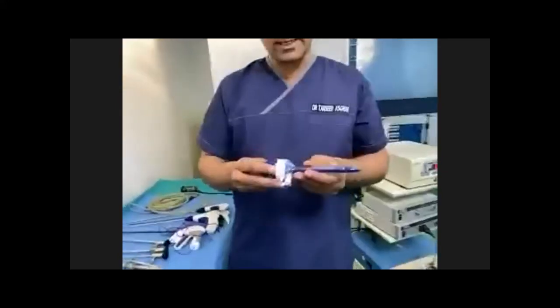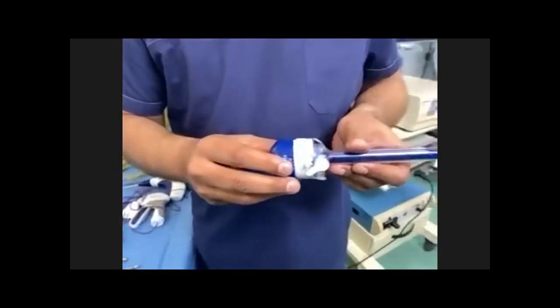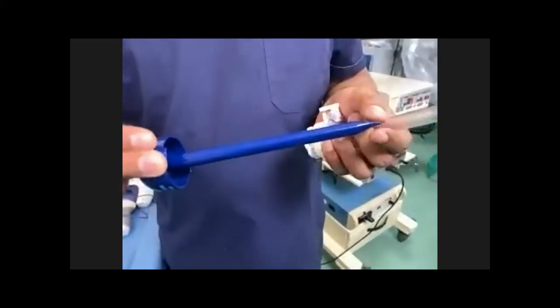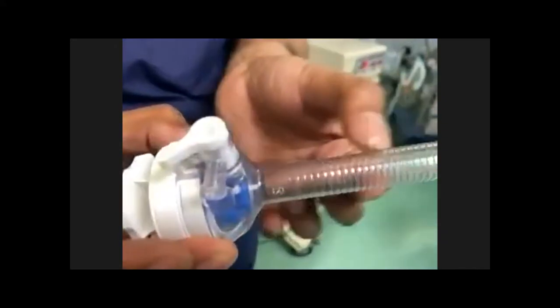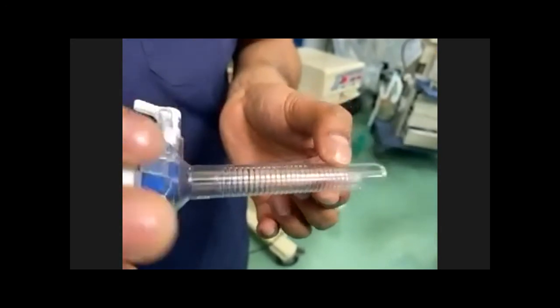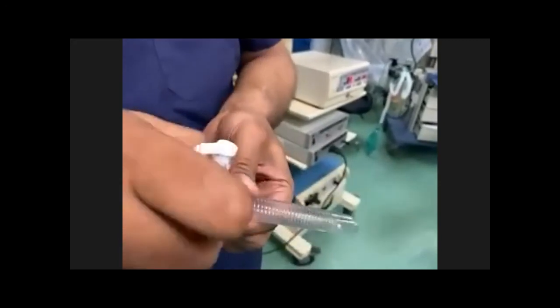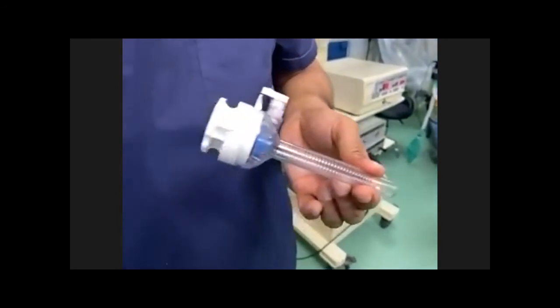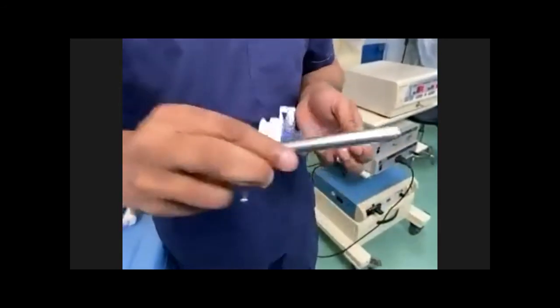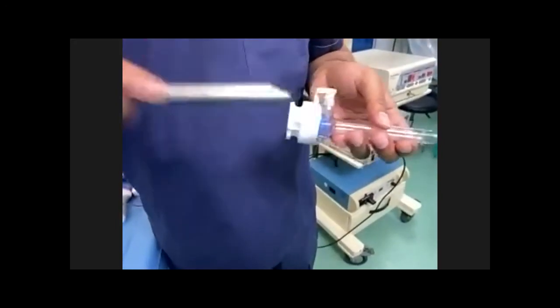And a trocar, which is a bladeless trocar, and it is 11 mm, and some companies make it 10 mm. Okay. It has also got a cannula, which I told you is a pyramid shape cannula. It has also got a shaft, and you can see the ridges over it right here. This is a very good trocar, but when you go in and rotate it clockwise and anti-clockwise, it doesn't allow the trocar to come out very easily when you are taking out the camera or taking out the instruments. On the other hand, if you use this trocar, which doesn't have these ridges, it can come out with the pull of the instrument.